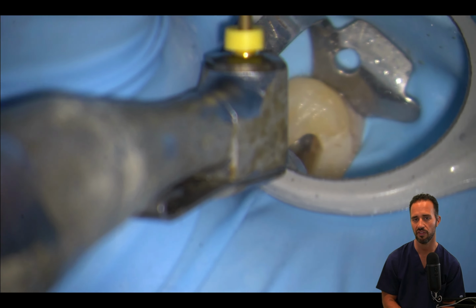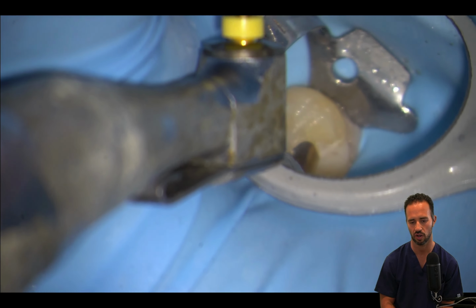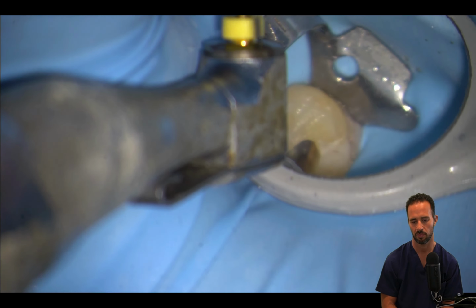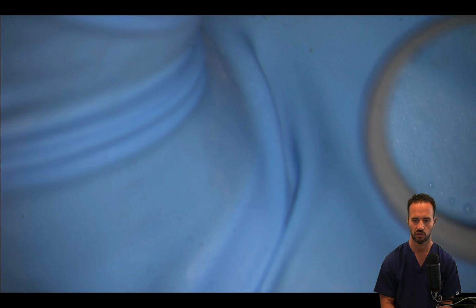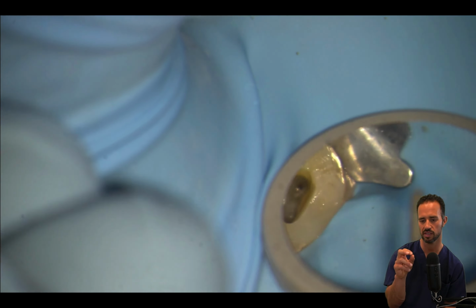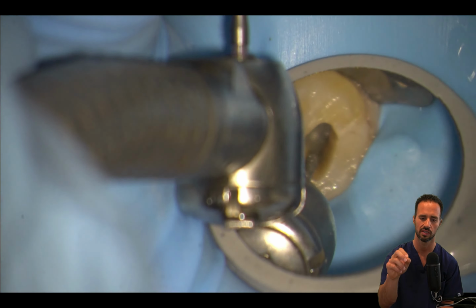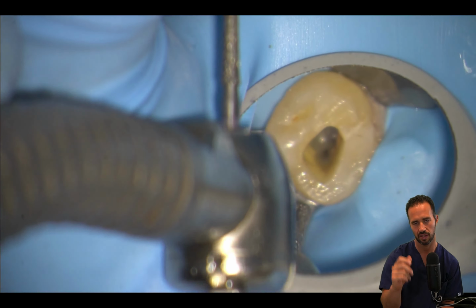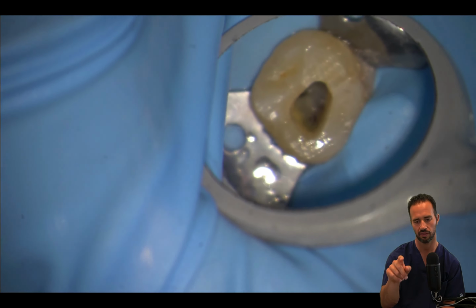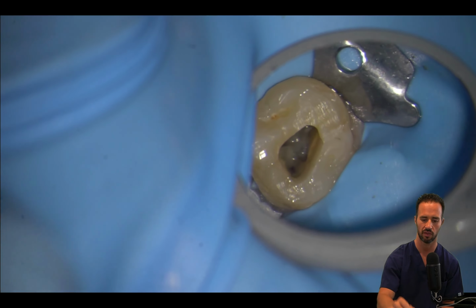And remember, this is a very gentle peck. This is not a hard push. The file shouldn't really bend a whole lot as you're doing this. You're just kind of poking in an area, because once that orifice opener touches an area where the canal is, it's going to get sucked up into that canal. So it's just kind of poking around and checking where you think it'll be.